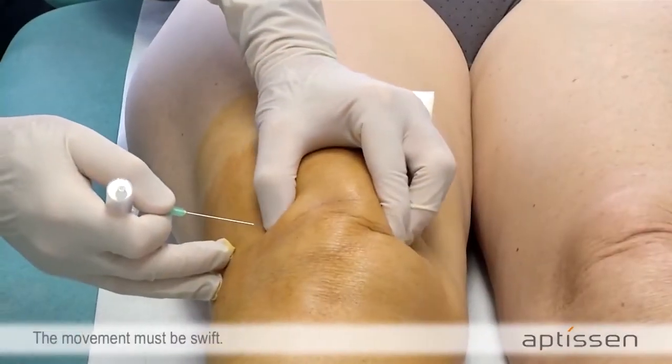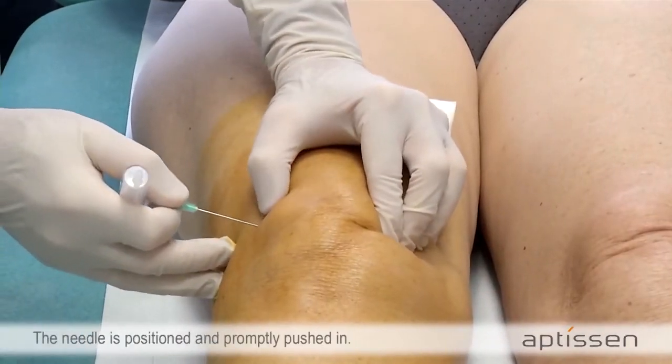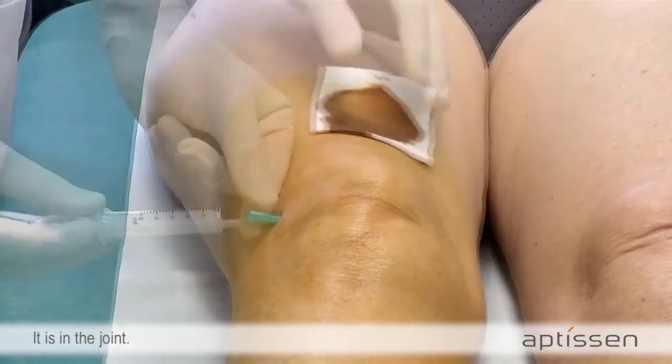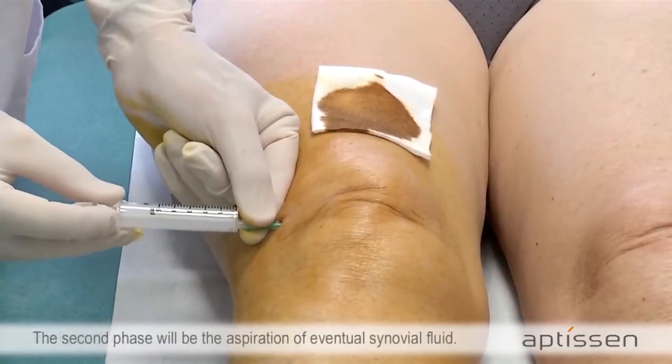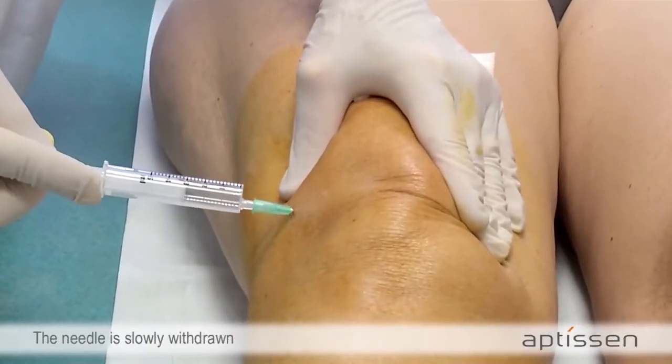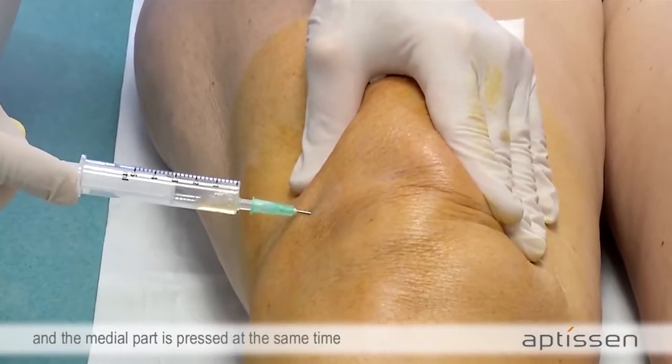The movement must be swift. The needle is positioned and promptly pushed in — it is in the joint. The second phase will be the aspiration of eventual synovial fluid. The needle is slowly withdrawn and the medial part is pressed at the same time.